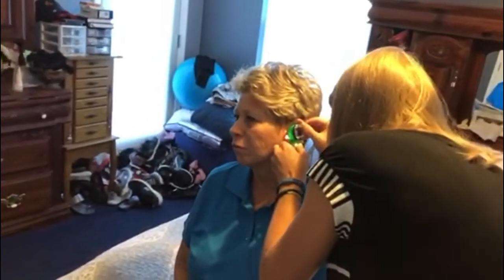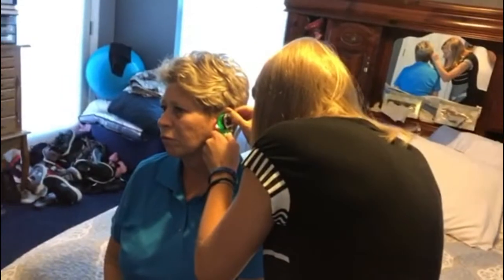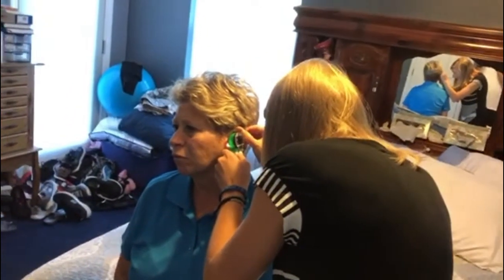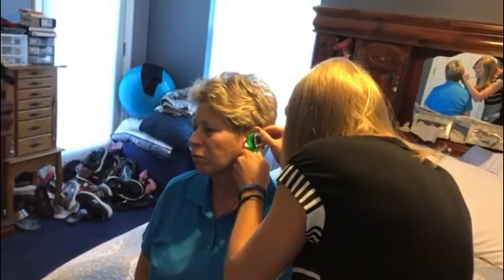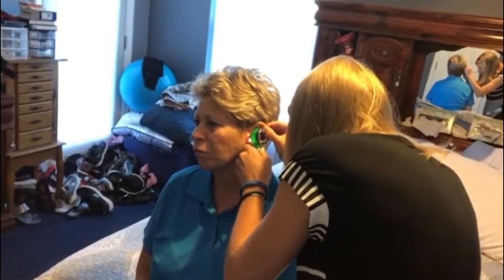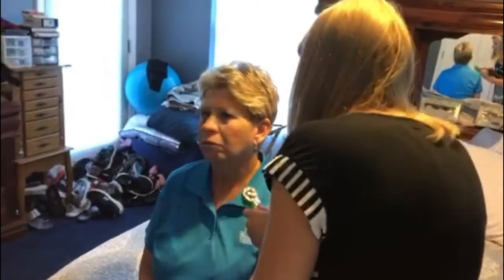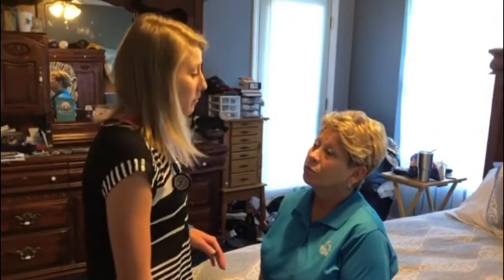There's also a little bit of cerumen on this side, but I can see the tympanic membrane again. The bony prominences are intact. There is no perforation. Her tympanic membrane is pearly gray on this side as well, with no redness or swelling, no drainage or anything like that. The patient's hearing has been intact the entire exam. She has been able to answer questions appropriately and follow. She has not had any issues with hearing during the assessment, which is a normal finding.